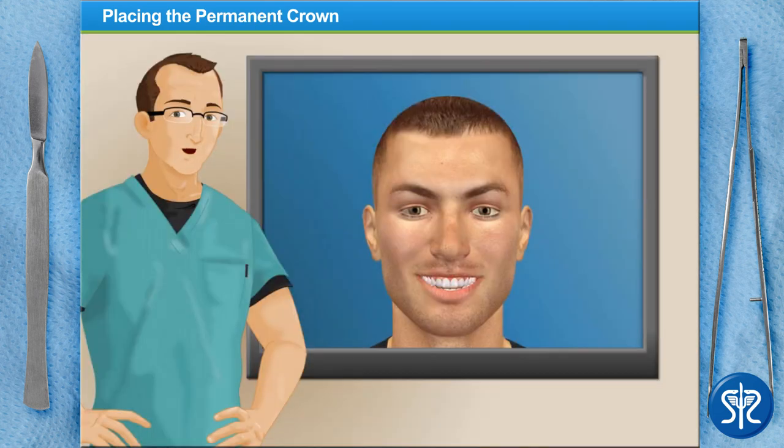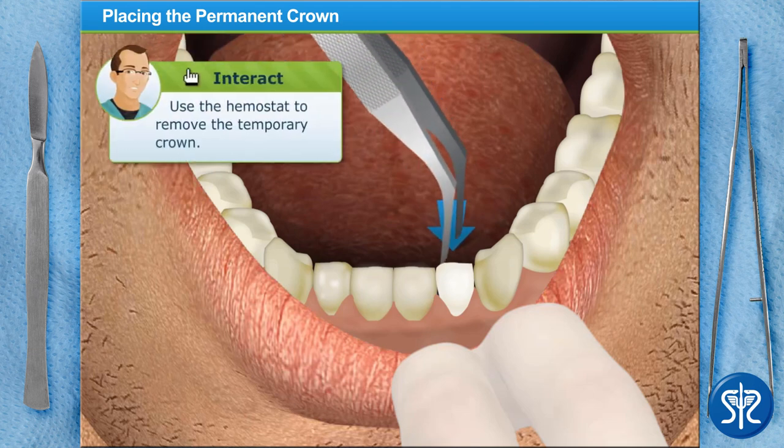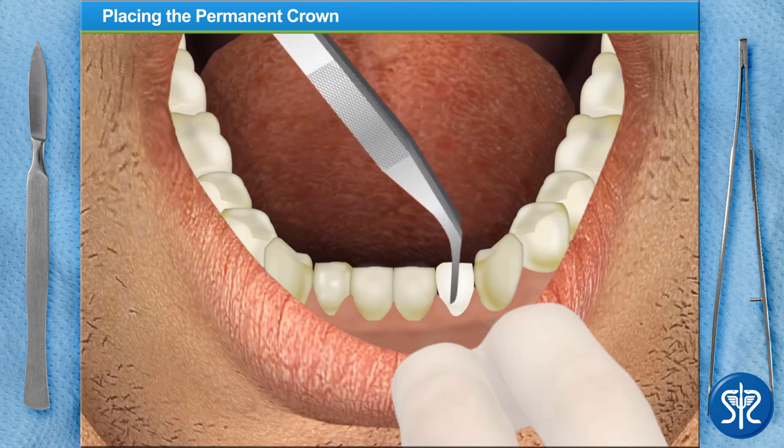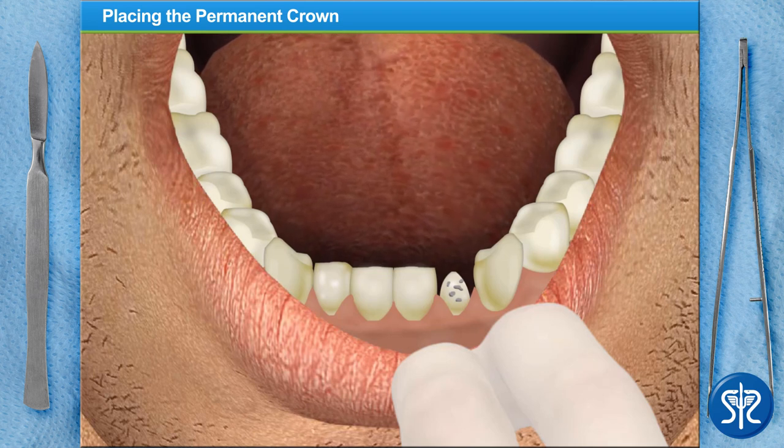Welcome back! Our patient has returned and is ready to have their permanent crown put on. Begin by using the dental hemostat to remove the temporary crown that we placed on the tooth last week. Now use the explorer to remove any excess temporary cement and debris.